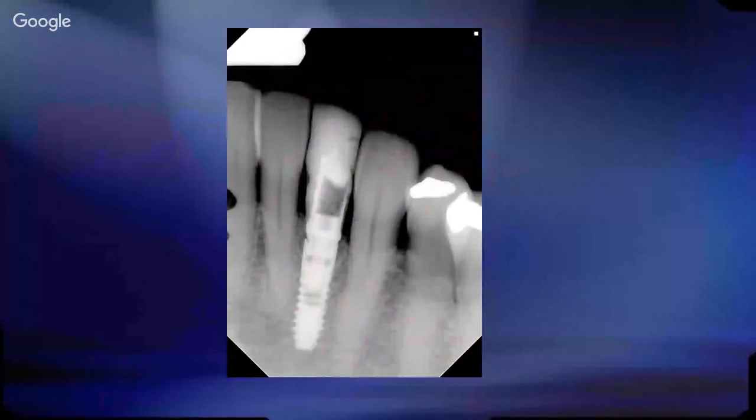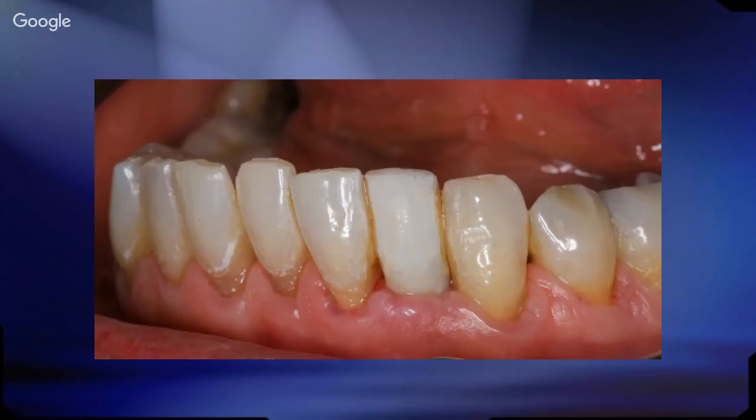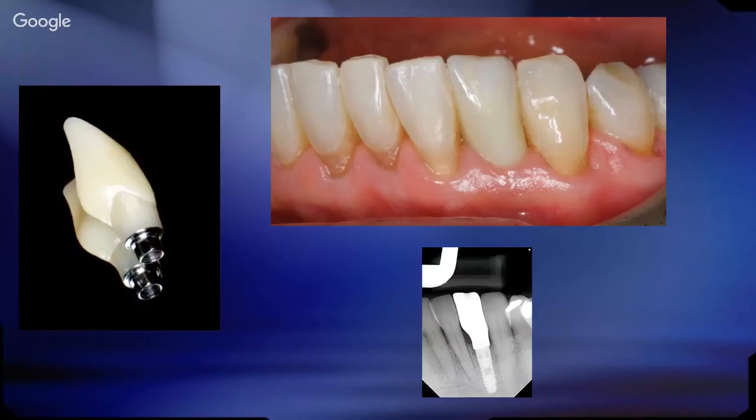Here's an immediate post-op scan of the temporary. You can see, and actually, I know people will be pointing this out as this video goes live, yes, the abutment wasn't seated all the way because there was some impingement on the bone, and we did address that, but this is what the x-ray looked like the day we put it in. And here's about a week post. This is actually 10 days post-op. It's looking pretty good. And then this is the final restoration, actually at 1 year.